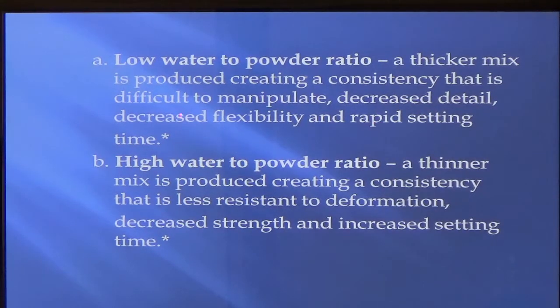The consistency is difficult to manipulate, decreased detail, decreased flexibility, and rapid set time. Okay, so if you're mixing and it's kind of lumpy, your water-powder ratio wasn't right. If it's the other way around, if you've got too much water, so high water to powder, then it's going to be a little bit too runny.